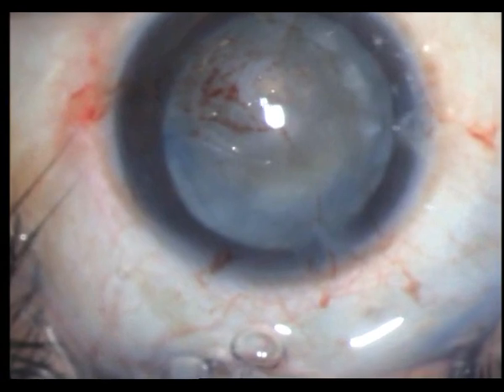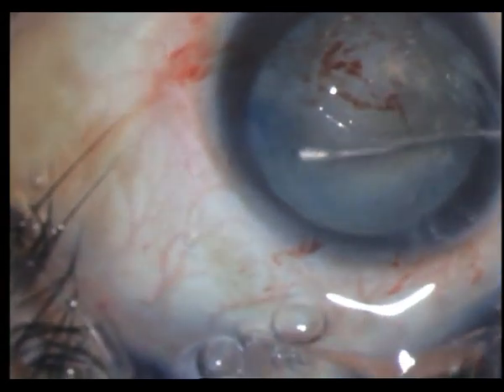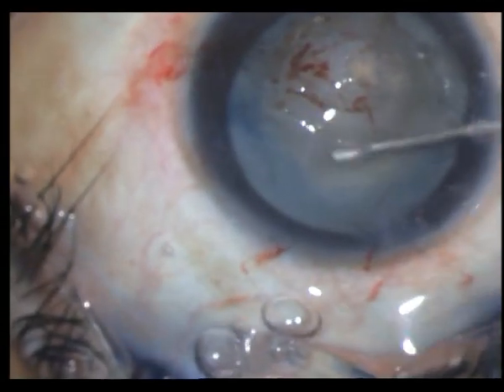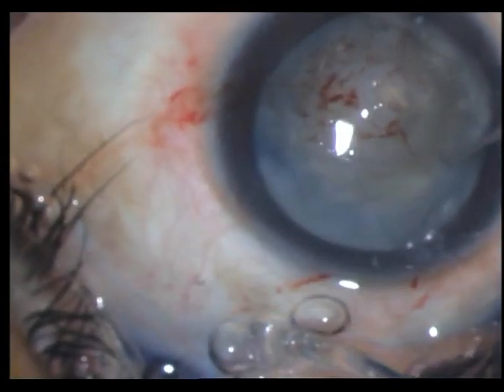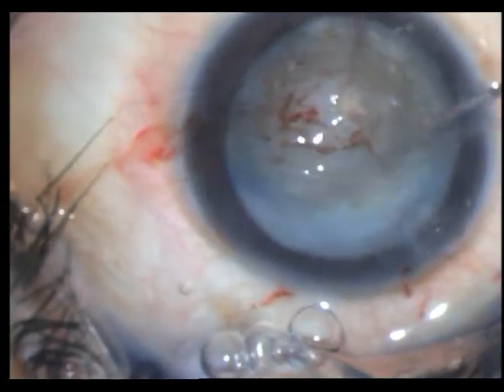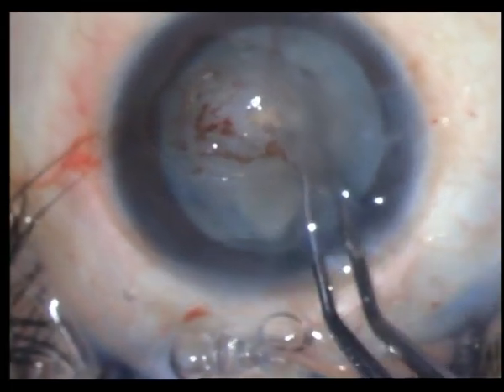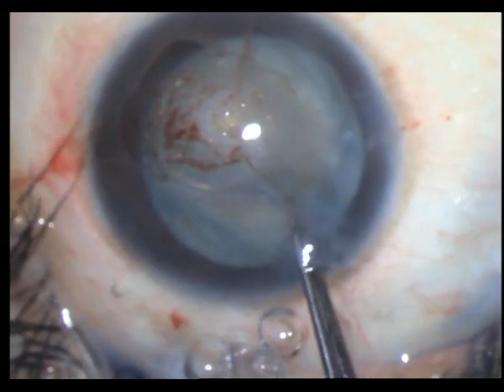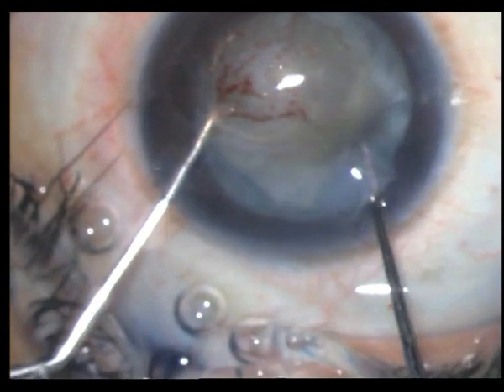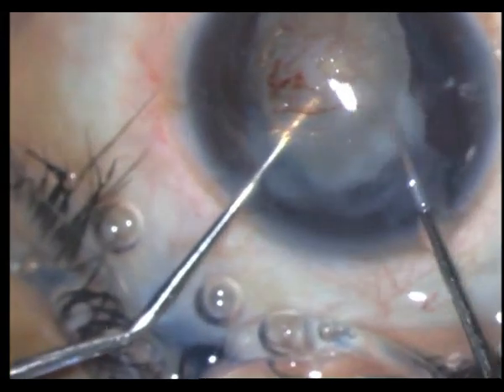Remember, she is a pathological myope — not a good idea to have a rupture in this case. So I do what I think is a better option: I go ahead and do a can-opener technique rather than trying to trace where my flap is and make a mess of the whole thing. I know this nucleus is pretty soft, so I'm not too worried about it. Making sure I can see the flap and bring out the anterior capsular flap — and now I have got it. Under HPMC — these moves all come from SICS, actually — I rotate the nucleus. It's a can-opener capsular flap, so I rotate the nucleus out into the anterior chamber.